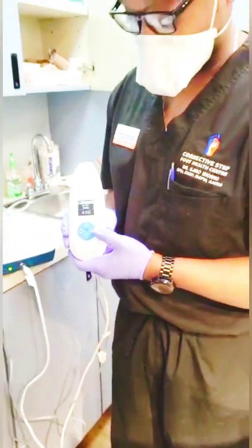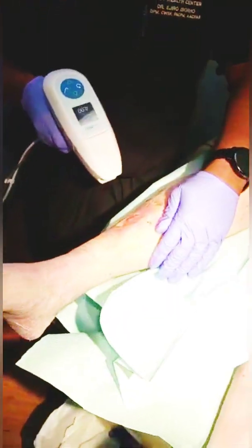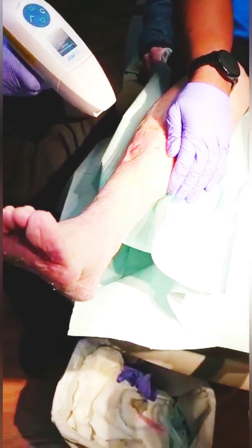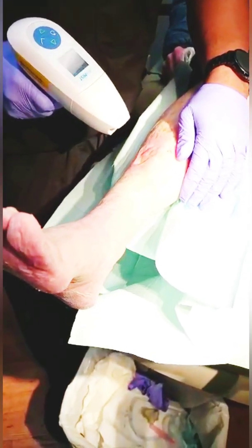We're going to press that and then press the trigger to get going. Basically, what you'll experience is 10 to 35 seconds of priming — about a 35-second delay until the fluid gets pulled through by the pump and starts actually spraying onto the wound. We'll actually see it coming through the clear holes very quickly too.